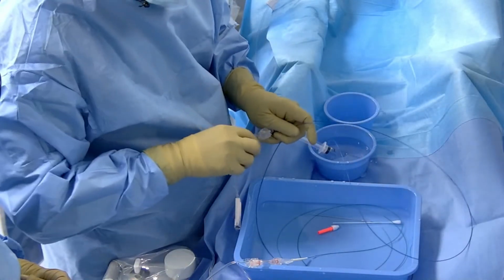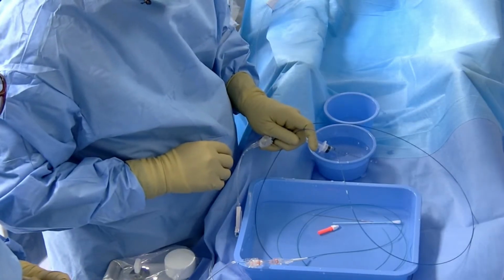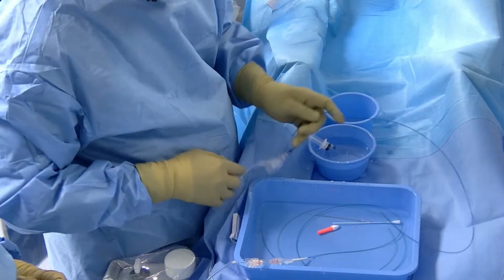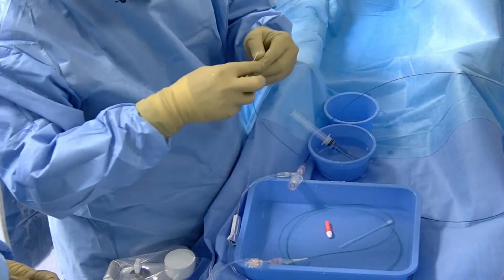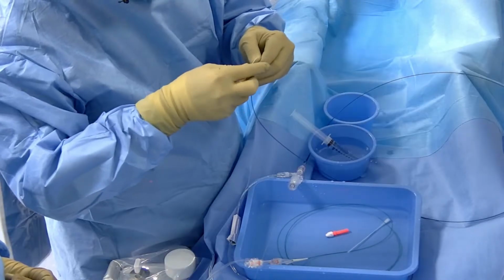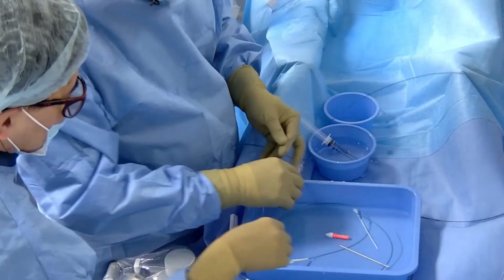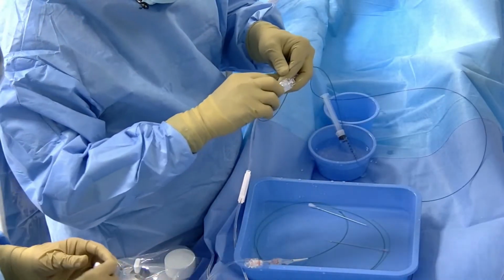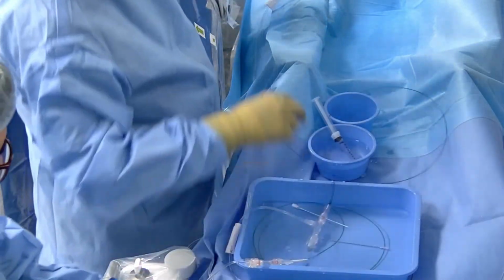Okay. There are two options how to open the Leo Baby Plus. One is from proximal to distal. The second is from distal to proximal. Okay. Yeah, sure.